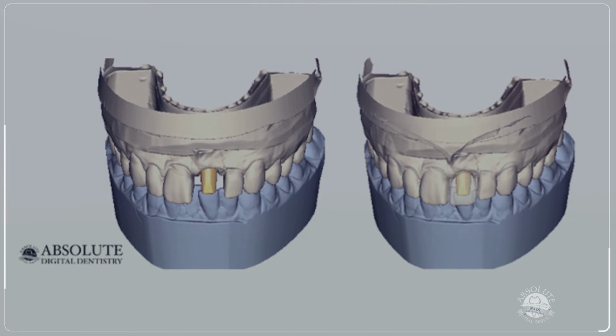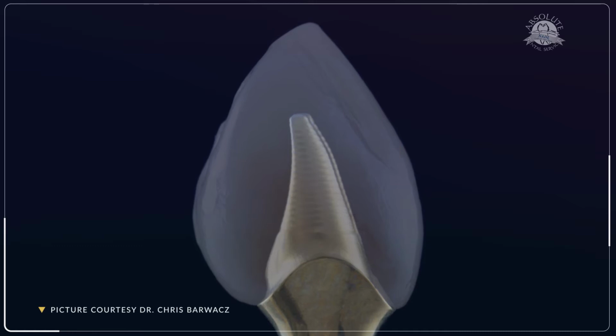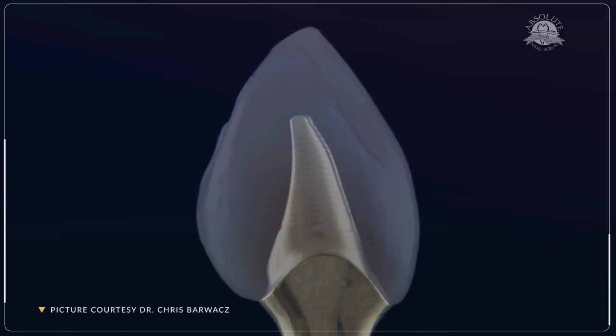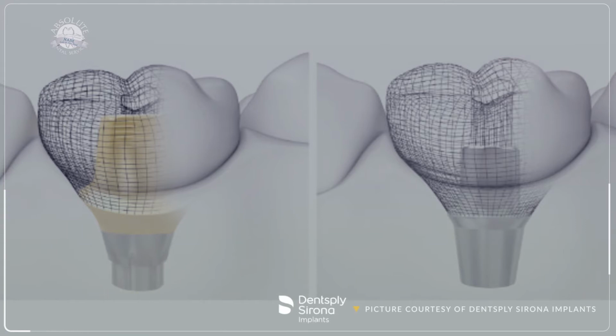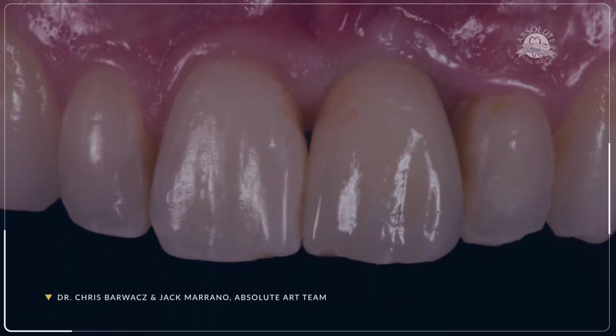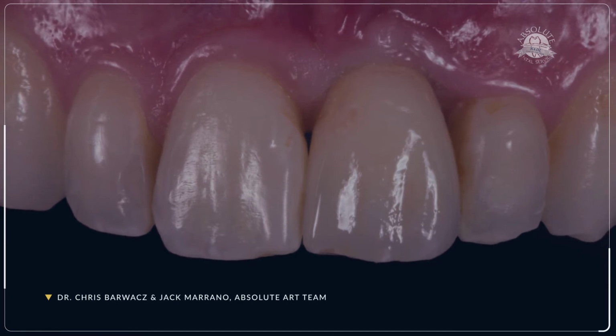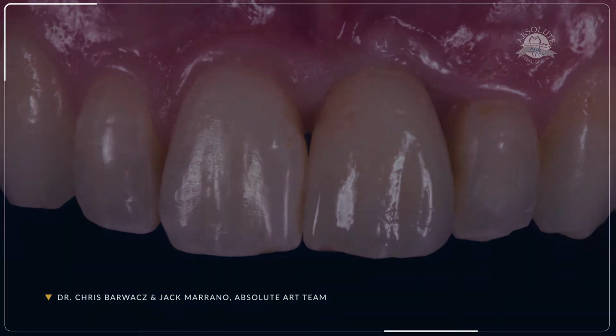That's right. I believe the most important part of restoring with these custom base abutments is the fact that we can control that emergence profile to height of contour. Right. Where with the stock titanium abutment, sometimes we have to overbulk with zirconia, and it makes it very tough to emerge. So height of contour is not just important for aesthetics, but also to control the tissue and hold that tissue cuff. Right, well what about a case where the screw access breaches the labial surface?